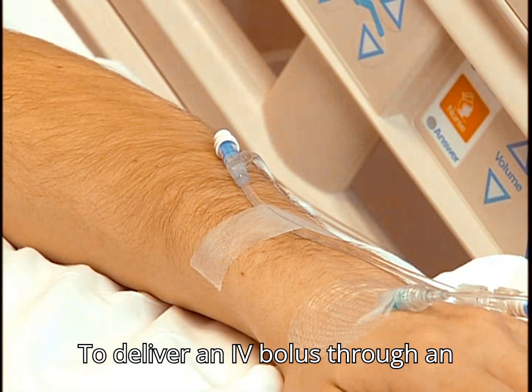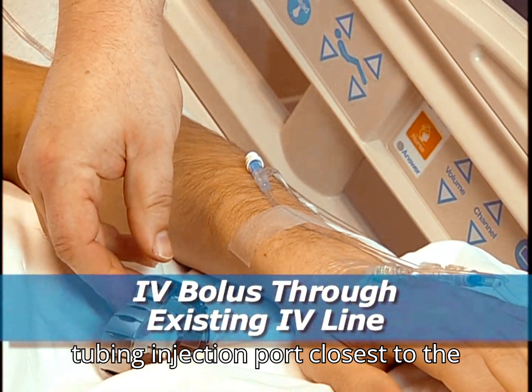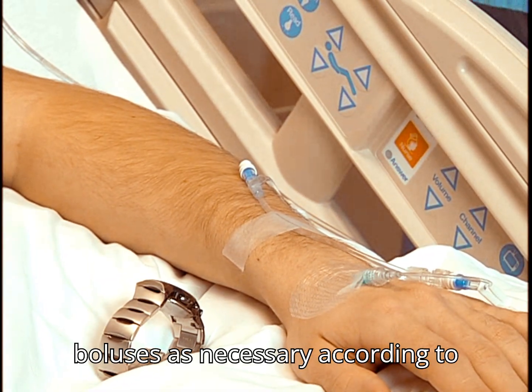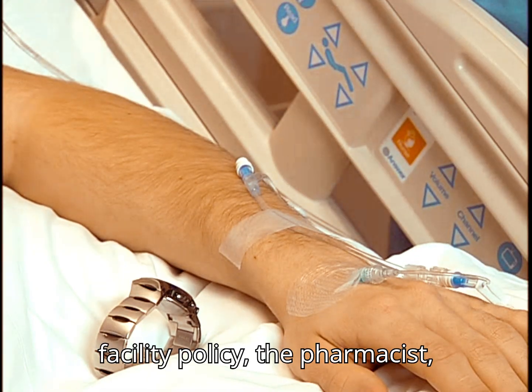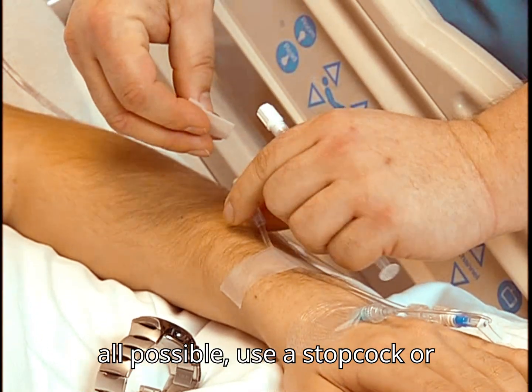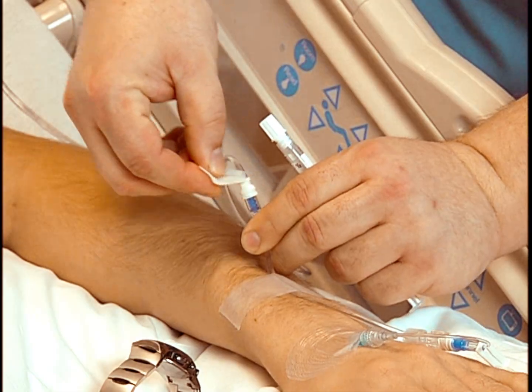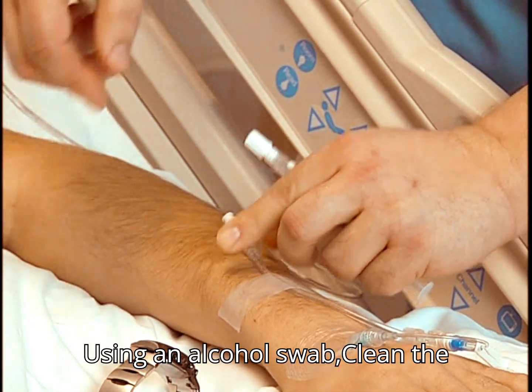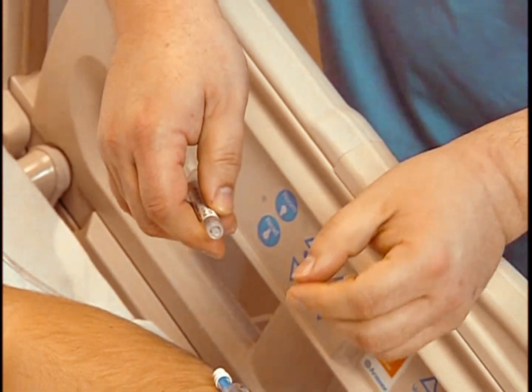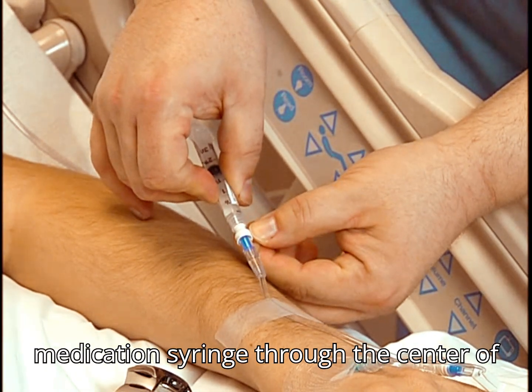To deliver an IV bolus through an existing line, locate the IV tubing injection port closest to the patient. Dilute IV bolus as necessary according to facility policy, the pharmacist, or a drug manual. If at all possible, use a stopcock or other needleless device. Using an alcohol swab, clean the injection port and let it dry.